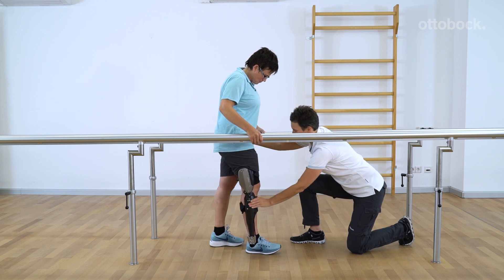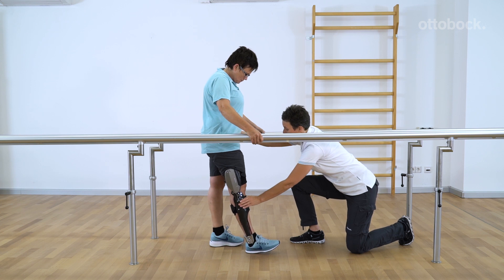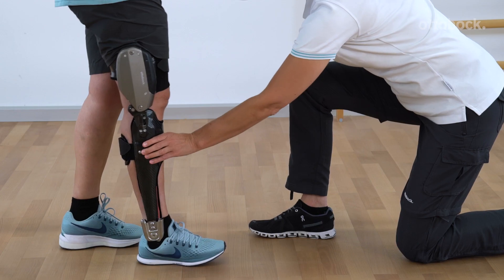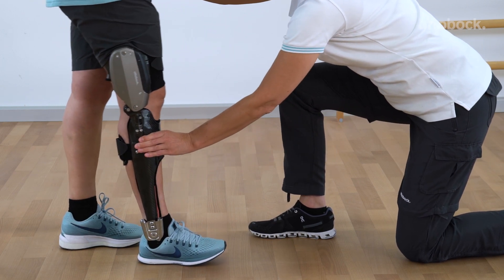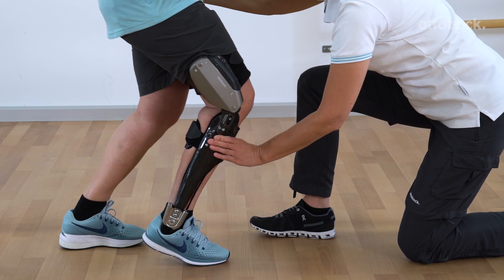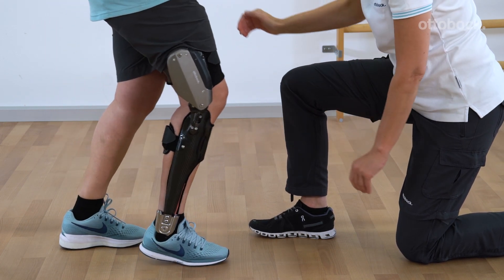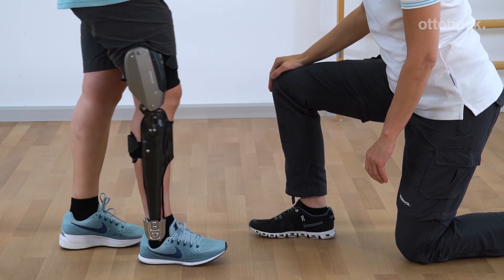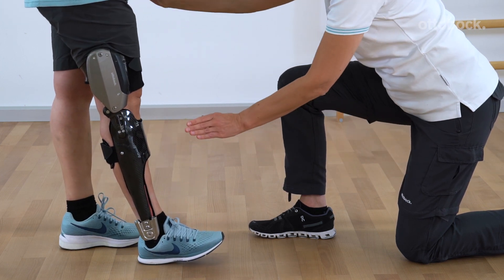Stance phase training establishes the basis for gait training. First, the patient develops a feel for the flexion resistance in the stance phase. The patient puts weight on the C-brace in the stride position and pushes the knee forward into knee flexion. The same resistance that was previously felt when sitting down is apparent, replacing the muscle function of the musculus quadriceps femoris.